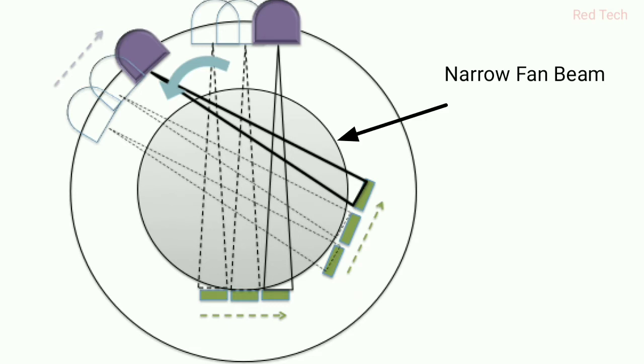This means one round takes 30 degrees, and one by one it takes 6 rounds to complete 180 degrees of the patient. Multiple slices could be taken by this generation, and the major disadvantage was an increase in scatter radiation. So that's all about second generation CT.